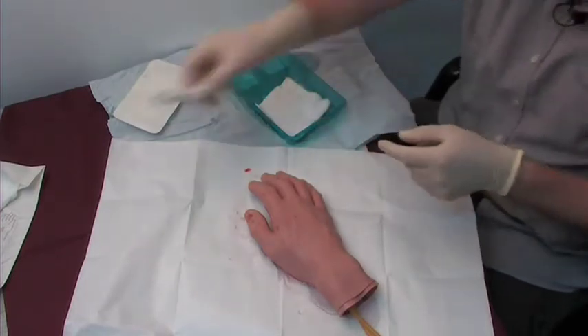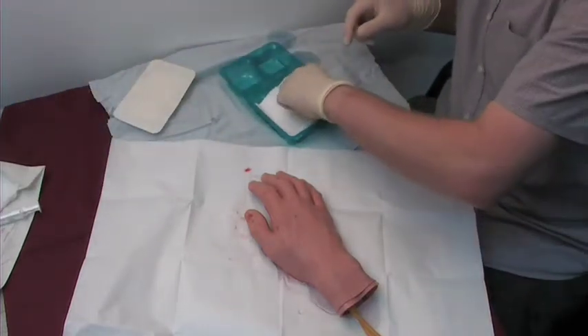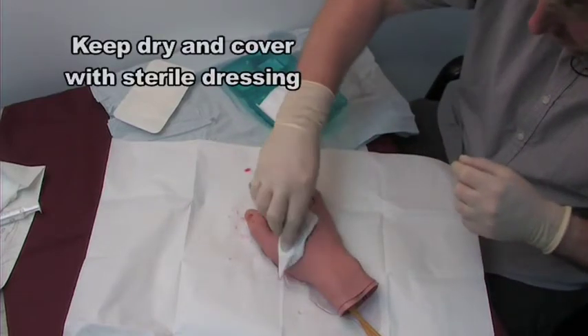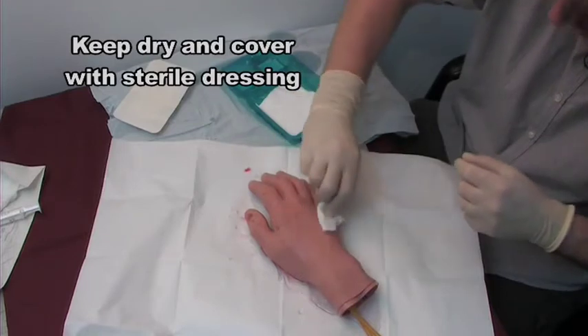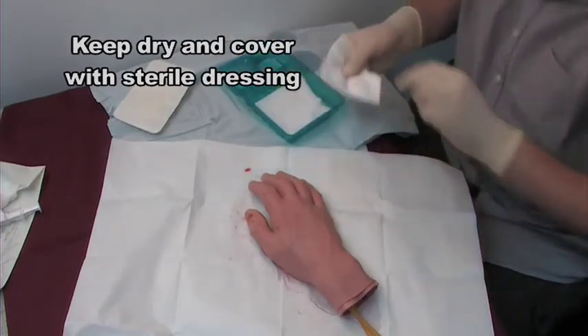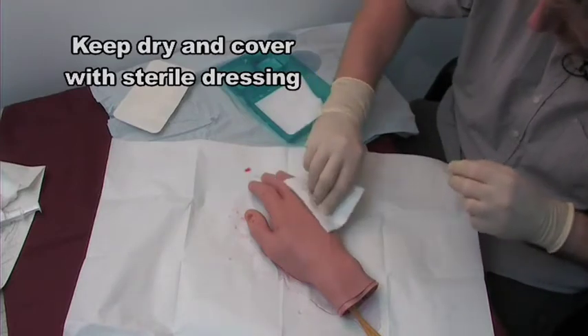When you've done that, discard and then use the remainder of the gauze just to dry the surrounding tissues of the wound so they'll be ready for the plaster to be applied.